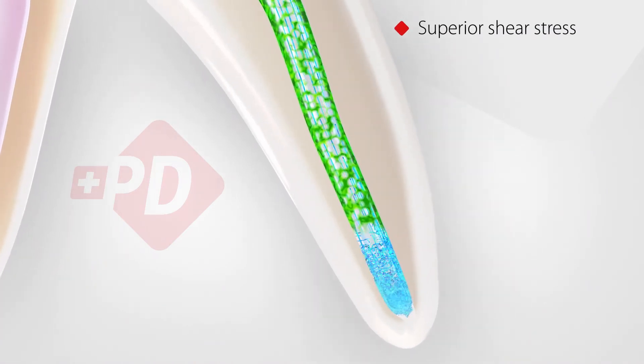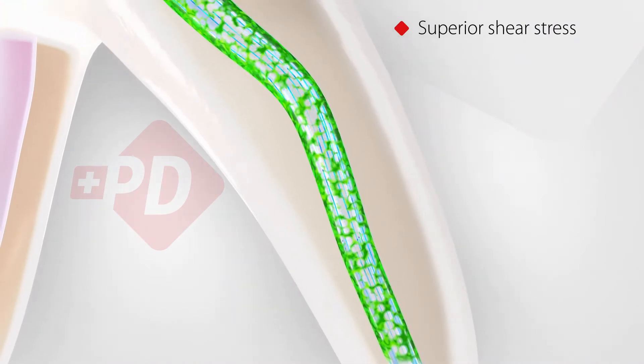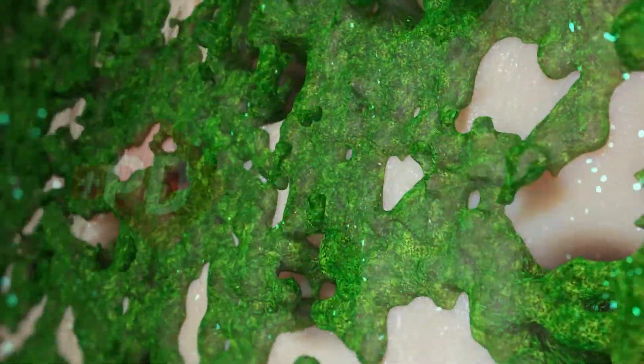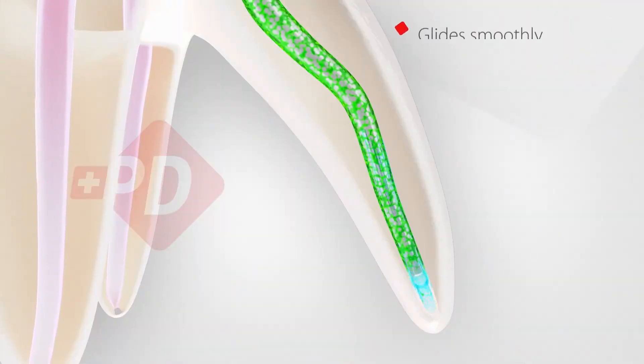Unlike conventional metal needles, the higher solution flow rate and the reduced space around the needle significantly increase the wall shear stress along the root canal. The superior shear stress improves the cleaning efficacy and mechanically removes more residues such as debris, smear layer, and biofilm from the root canal walls.